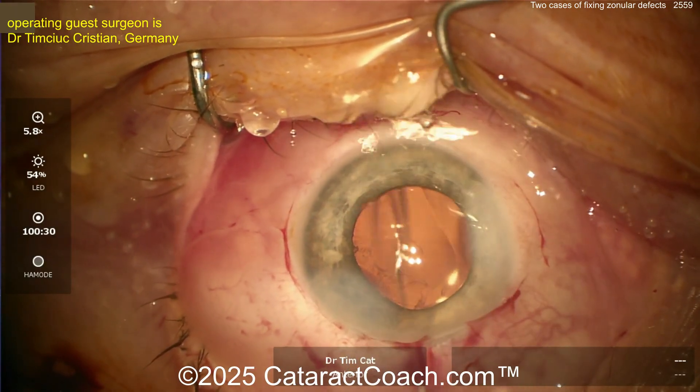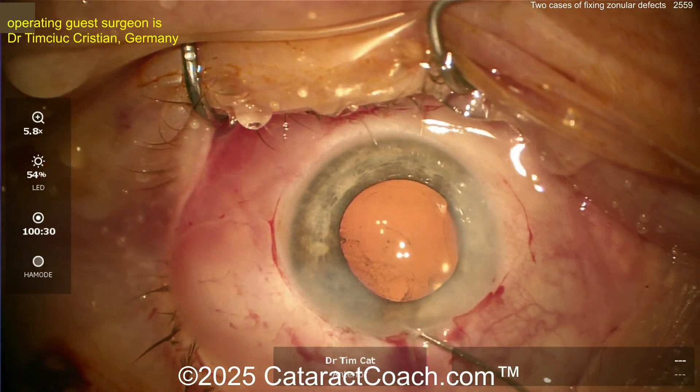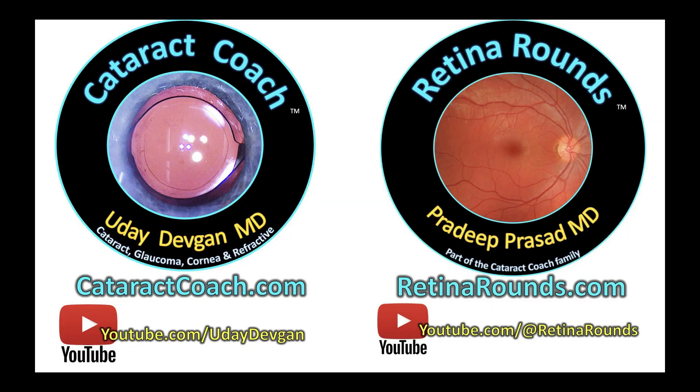Let's seal the incision. In a case like this, you may want to shake the eye a little bit just to judge if there's any pseudophacodonesis — and hey, it looks pretty good! Remember, check out retinarounds.com, our sister channel — so much great material; you will absolutely love it.